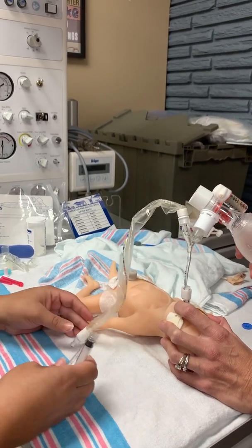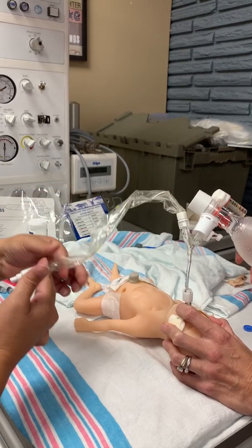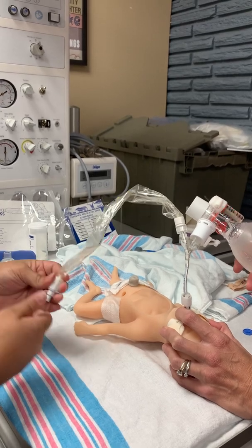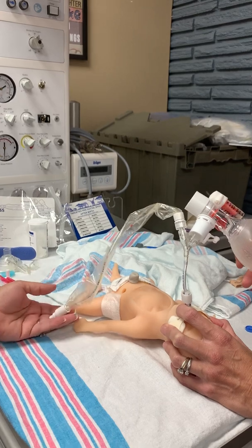But once that hour or two has passed, now we're going to change this catheter for safety reasons, because we don't want to just hook up suction tubing here. So we're going to change this catheter to an actual suction catheter.